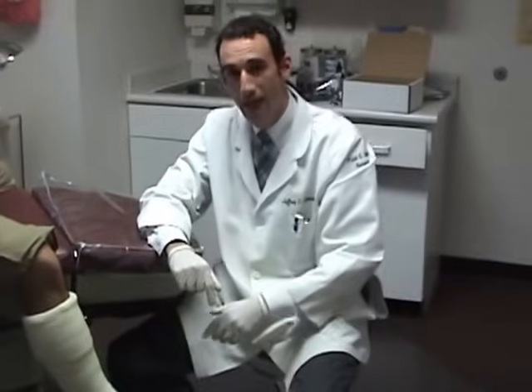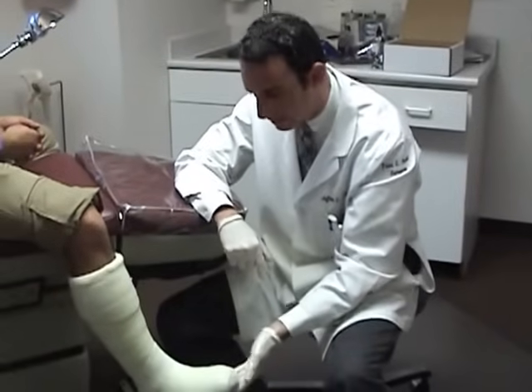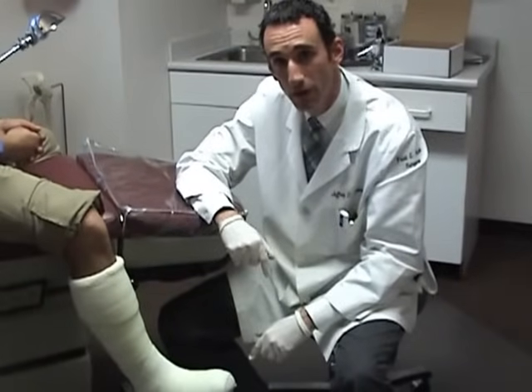We give them a cast shoe that attaches with Velcro straps for them to walk on the bottom. This is a solid total contact cast that they will be able to walk on.